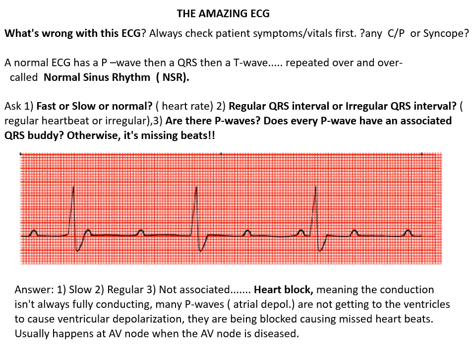Okay. Is it regular or irregular? When we ask that question, we're looking at the QRS. Is the heart pumping in a regular fashion or in an irregular fashion? And if you were to calculate the distance between these QRSs, they would be exactly at the same distance, which is really a measurement of time. Okay? And lastly, are there P waves that are consistently before the QRS?